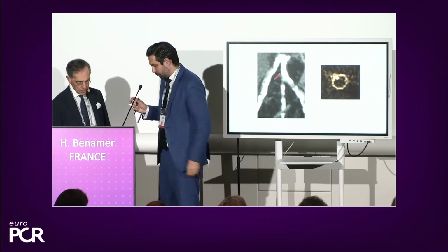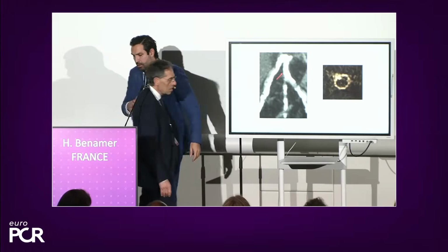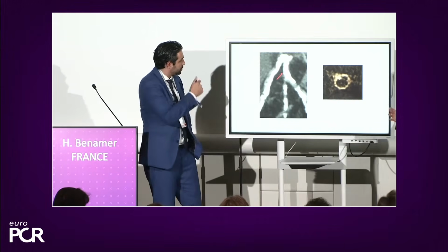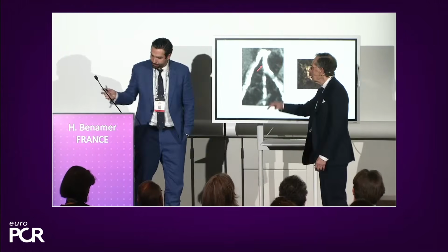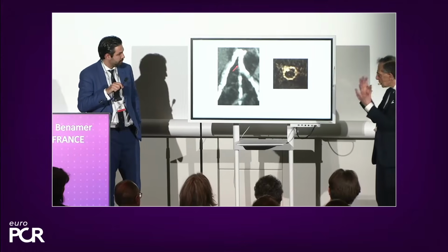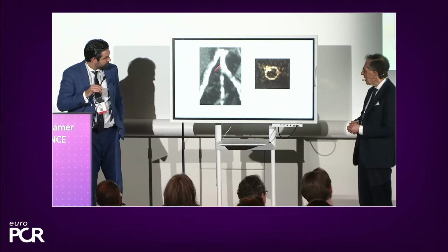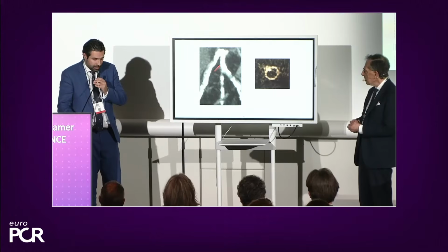Okay. Let's have a look at this first picture. So calcium, we were talking about calcium, and we said, well, calcium can be detected in multiple patients. Blooming. Normally, sometimes when you're using some technology, you cannot be in focus because there is blooming. What about this technology with the calcium? It's going to be obscured, can we see blooming? So that's a very good point.